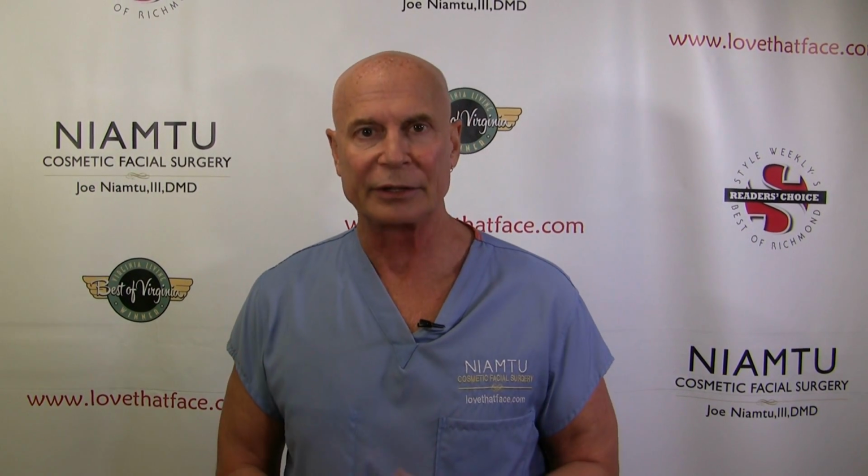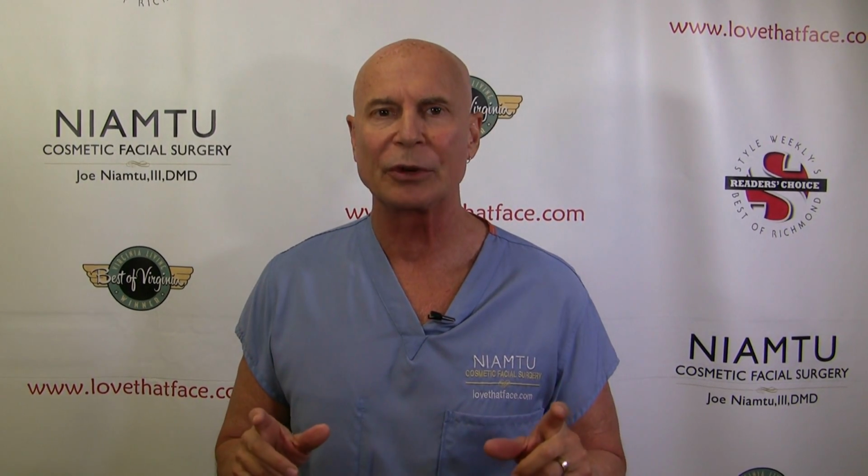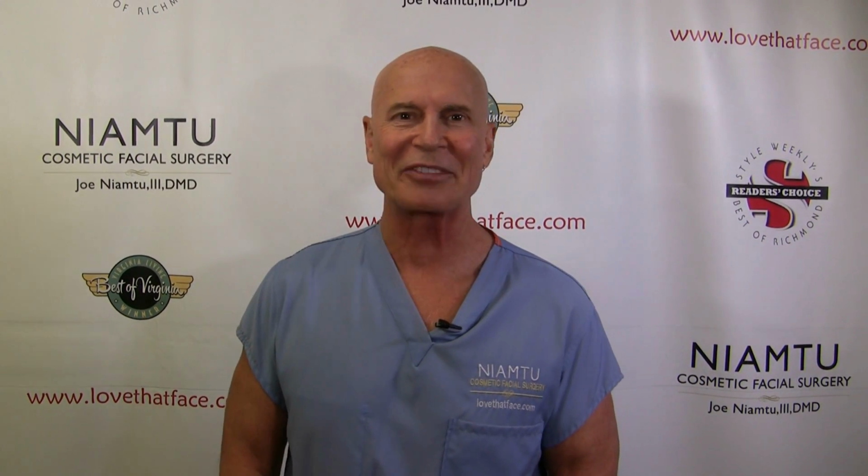And it can be very confusing at first because there's a wide array of different implants in sizes and shapes. So I'm going to show you a way that I think works really well where you can treat almost any patient with one of three implant choices: a submalar, a malar shell, or a combined submalar implant. So we're going to show you on a patient how we do this and what we look for, and educate people a little bit about implant selection in terms of what type, what size, what form, what morphology. I'm Dr. Joe Niamtu, LoveThatFace.com.